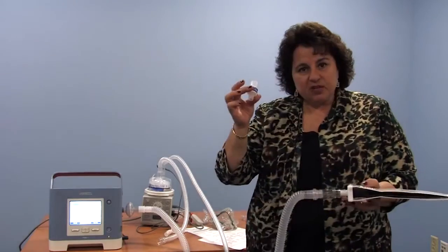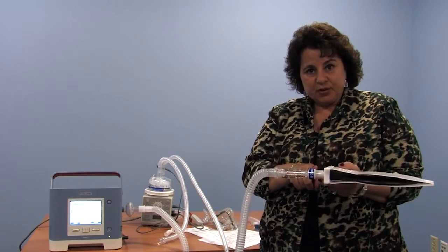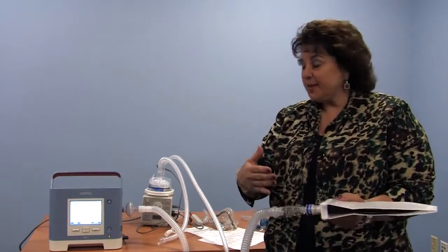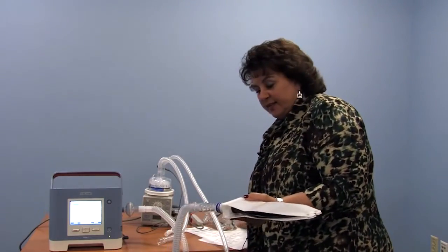In addition, for patients with a tracheostomy tube, we can add the heat moisture exchanger. Our child will have the advantage of the heat moisture exchanger, which will gather heat and moisture from the patient's exhaled air and try to give it back during inhalation. So it's not quite a perfect system, not like this at home, but it typically works very well. For tolerance, just try increasing the time that your child uses this device. And I do need to point out to you that the size of the device does matter.